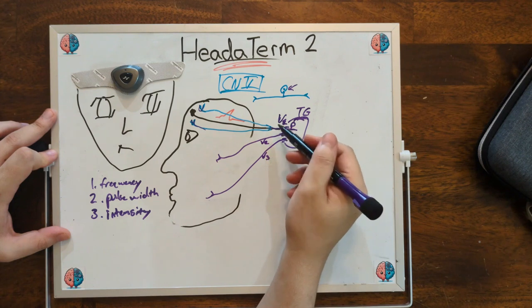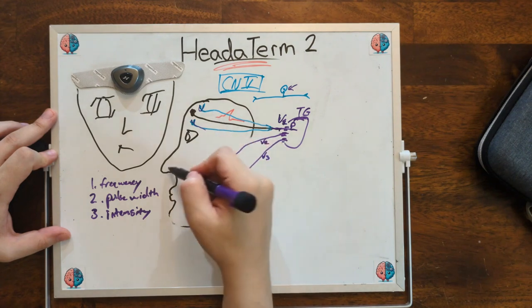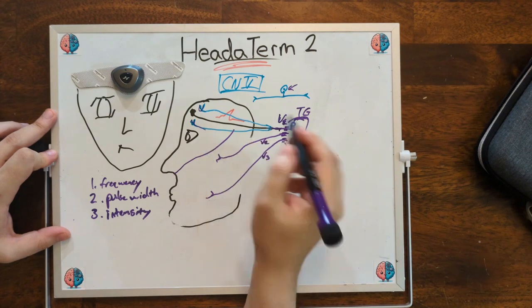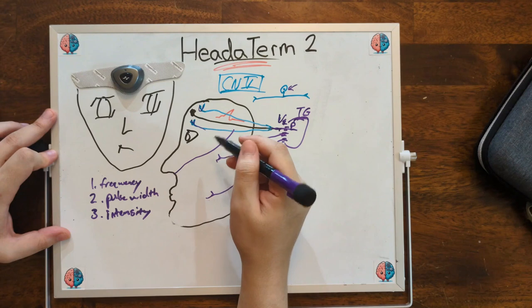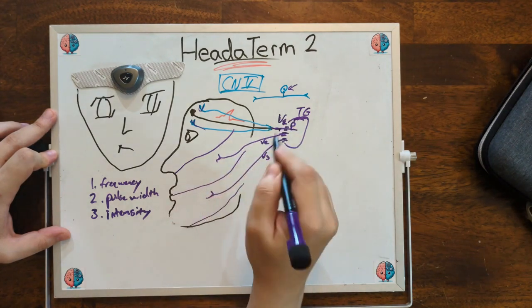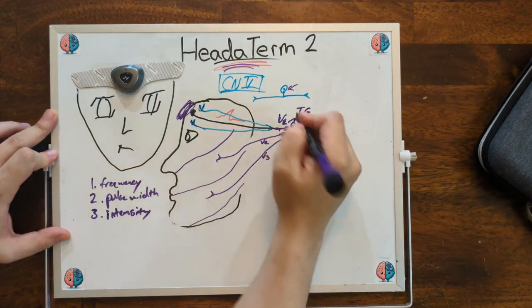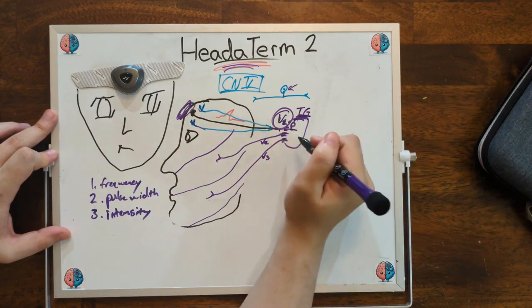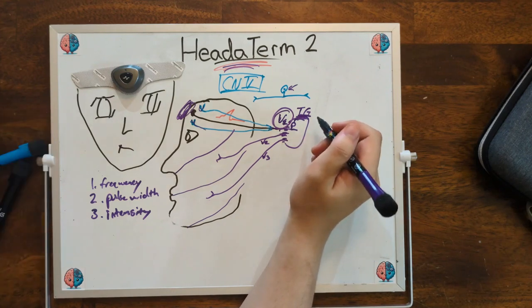The ophthalmic nerve, the one we want to focus on, V1, innervates the forehead, the dorsum of the nose, upper eyelid, orbit, including the cornea and conjunctiva, and other things that aren't visible in this drawing, like the mucous membranes of the nasal vestibule and frontal sinus and cranial dura. And then V2 and V3. So when the device activates, it's on the forehead. So what we care about is the V1 division of the trigeminal ganglion. And they represent a gateway to the trigeminal vascular system, which is an important part of migraine pathophysiology.